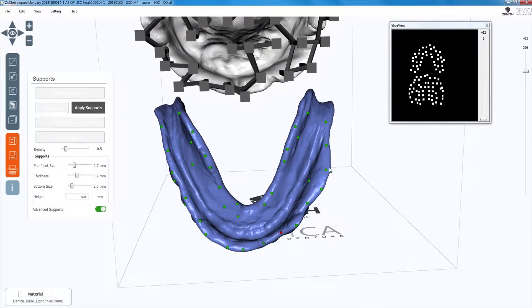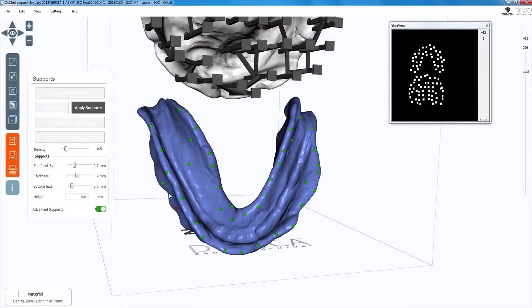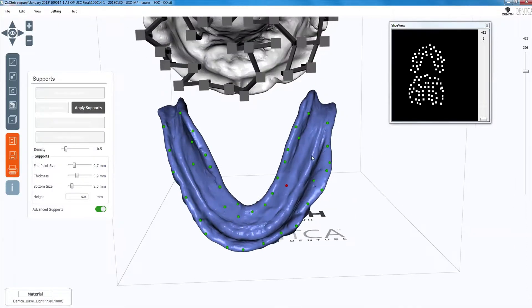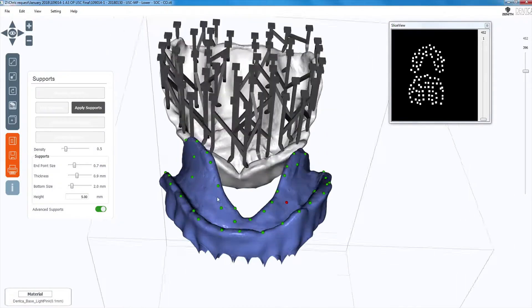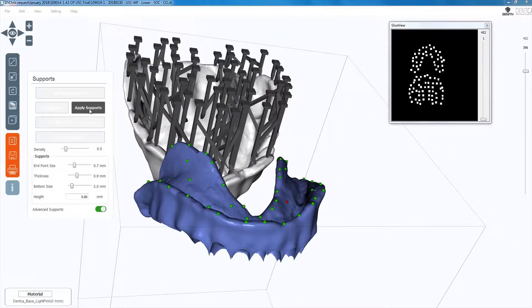If you add too many supports, you will spend more time post-processing. Once adjusted, click on apply supports. Repeat the same steps on the lower arch. When creating supports on the mandibular arch, ensure to create additional ones on the posterior area to increase stability to the denture.